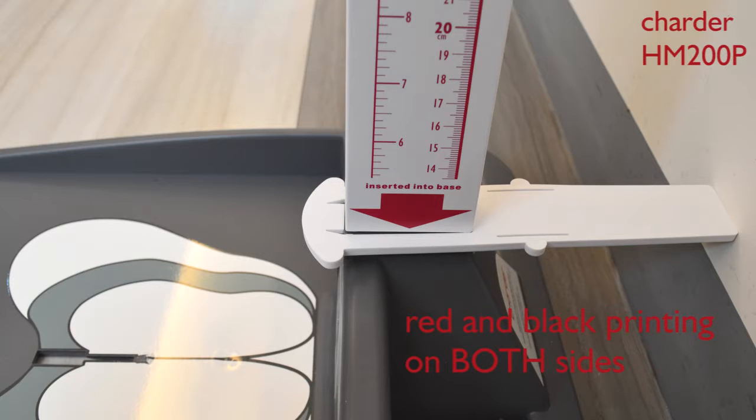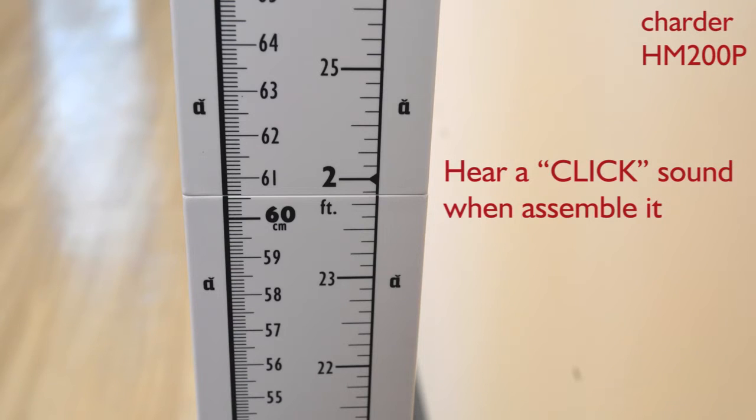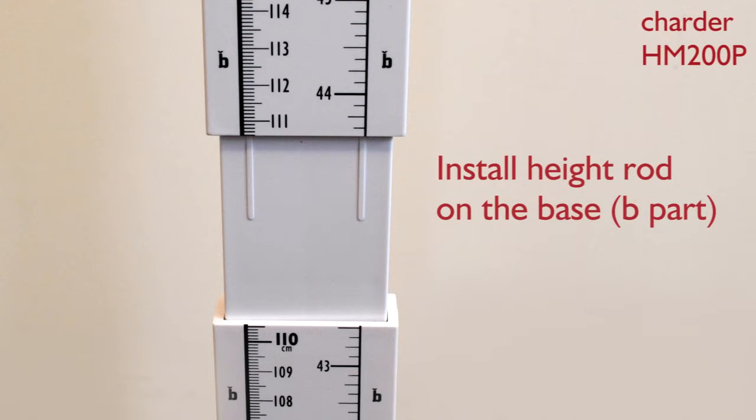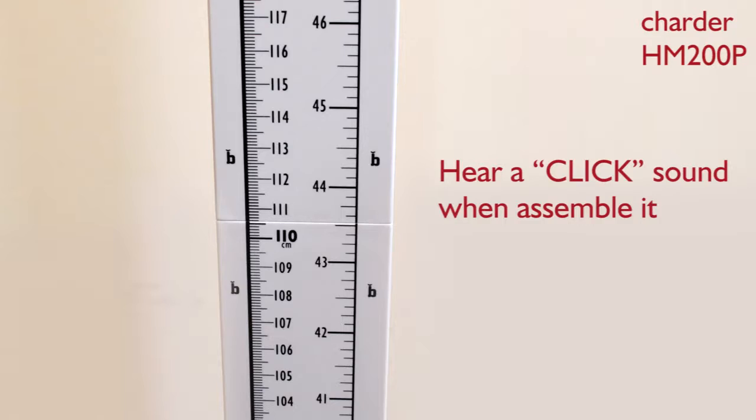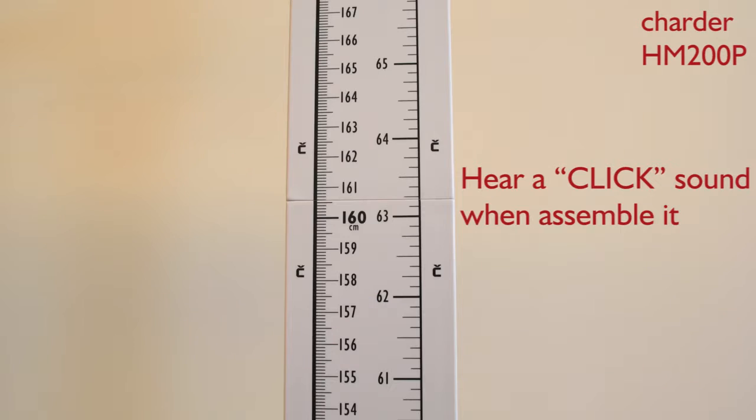One side of printing is red, the other side is black. Assemble rod A and A together, then rod B and B together, then rod C and C together. Each connection is secure when you hear a click sound.